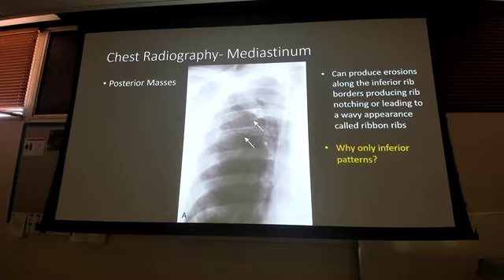Because what's happening with this one is, from what I know from neuro, from talking with Colonel Rogers, a lot of the tumors that go on underneath those ribs would be more kind of lytic. Remember how we talked about earlier the lytic lesions versus the osteoblastic lesions? We talked about radio-opaque versus radiolucent. The ones that are more common, and I don't know the names of them or anything, underneath the inferior ribs are more lytic type tumors and lesions. So that's why it eats away at the bone instead of producing.